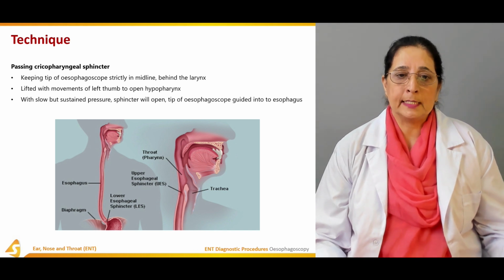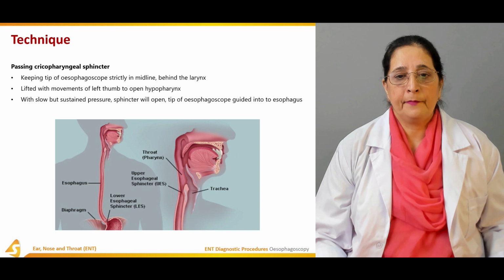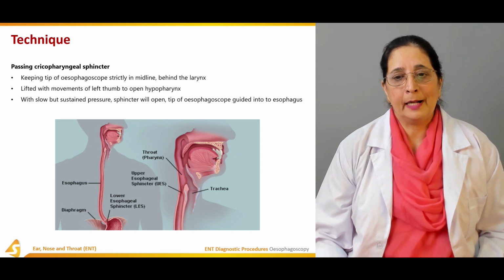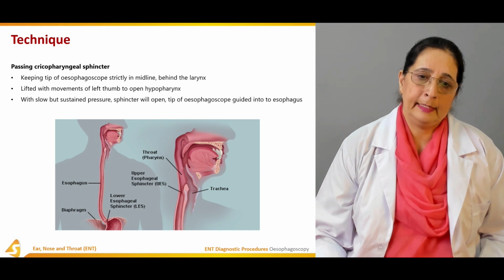With slow but sustained pressure, the sphincter will open and the tip of the esophagoscope is guided into the esophagus.